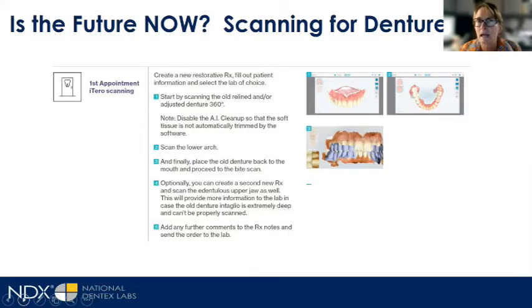The second challenge, if you will, is to go very, very slowly. Mentally, we've been taught for the last many years to scan quickly, right? Everybody wants to scan a little faster, a little faster, a little faster when it comes to full arch scans for Invisalign or splints or even crowns and bridges. You want to be effective and proficient and quick. You want to be the opposite, really, when it comes to scanning fully edentulous, whether it's scanning the denture itself or you're scanning the oral cavity.